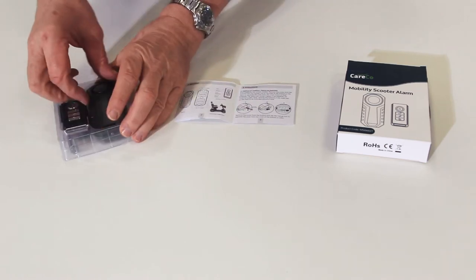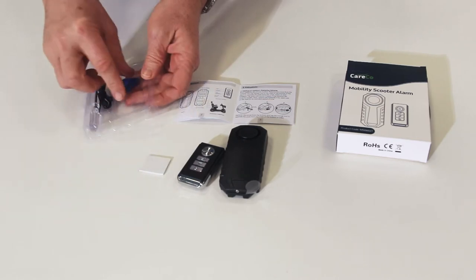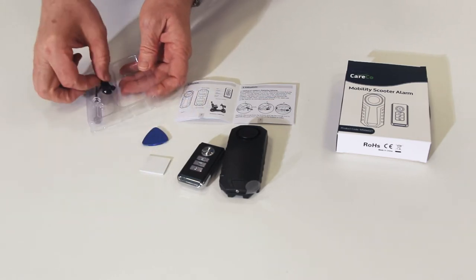Along with the scooter alarm itself, you'll also find a small remote, adhesive labels, a triangle tool, cable ties and a small screwdriver.